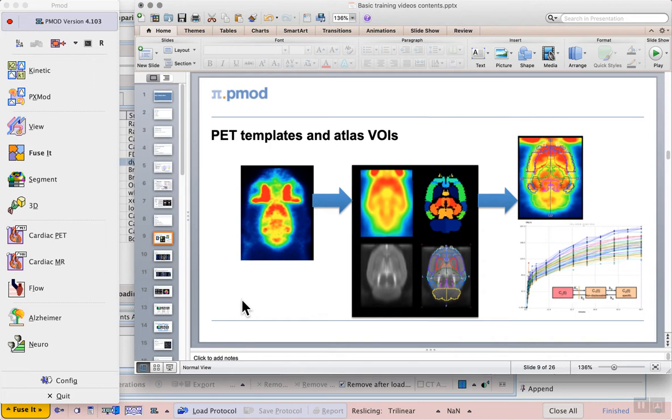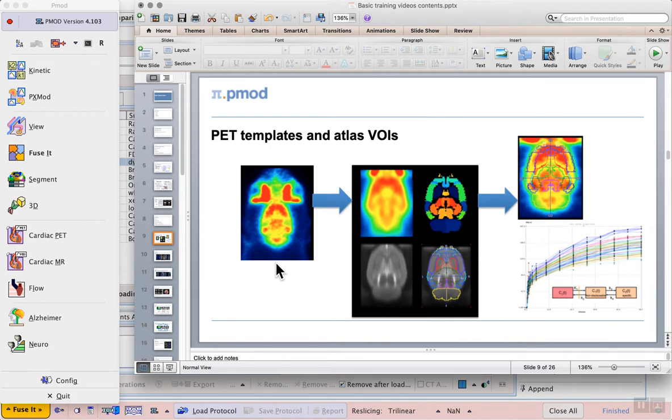FDG is a good example of a tracer where direct PET-to-PET template matching is possible. On the left of this slide we see the individual RAT-FDG in the brain that we will work with in this example. This will be matched to the PET template that is part of a general set of resources in the FUSE-IT tool.